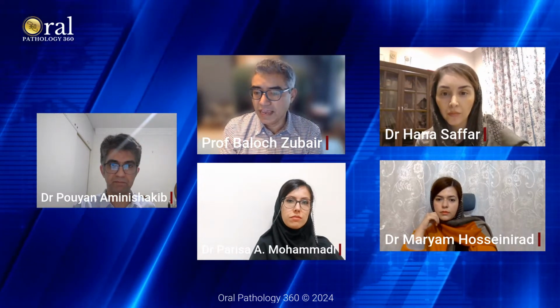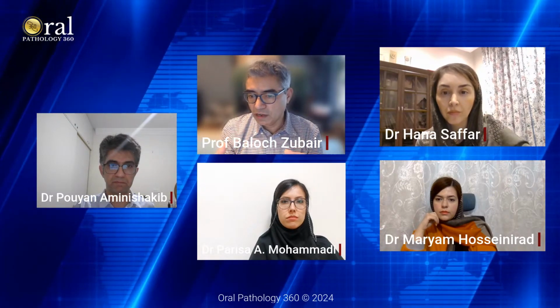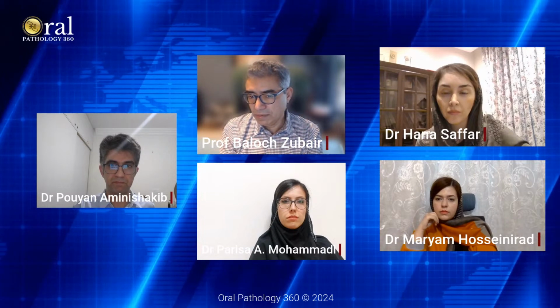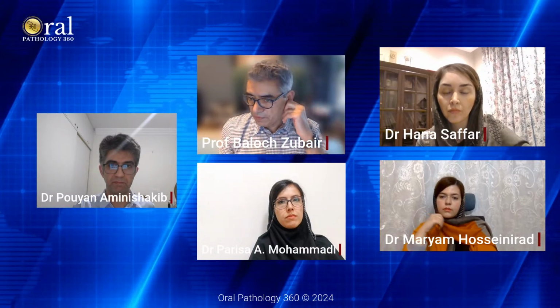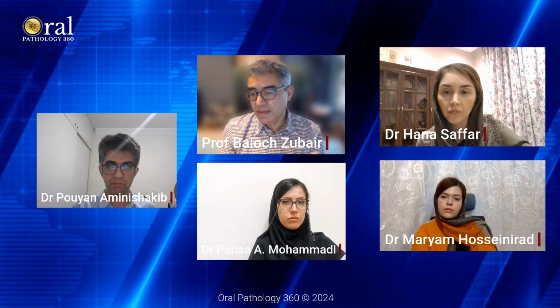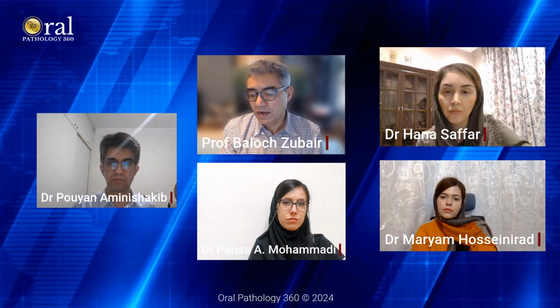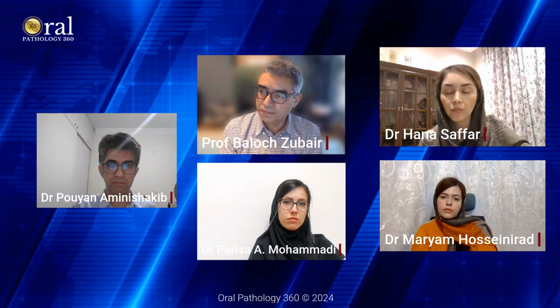I will tell them I have been lucky with MAML2, because you can do it on a Diff-Quik air-dried smear, or you can do the FISH on the cell block. We can do that. Some people do NGS on the whole range, but it may not be possible on a limited cellularity specimen. So I think that is my approach to these cases.